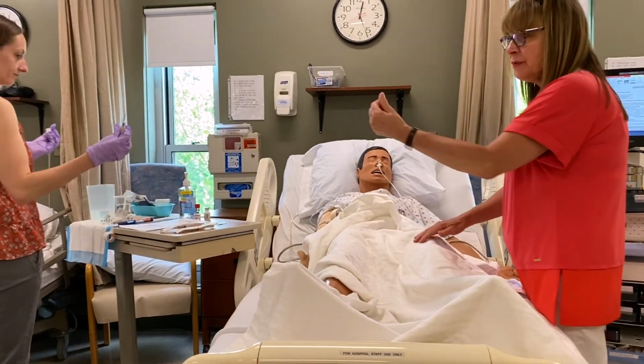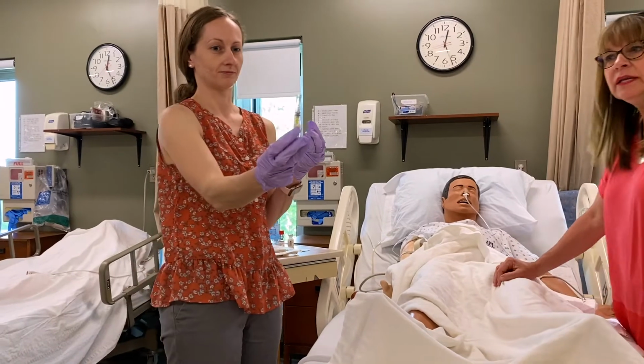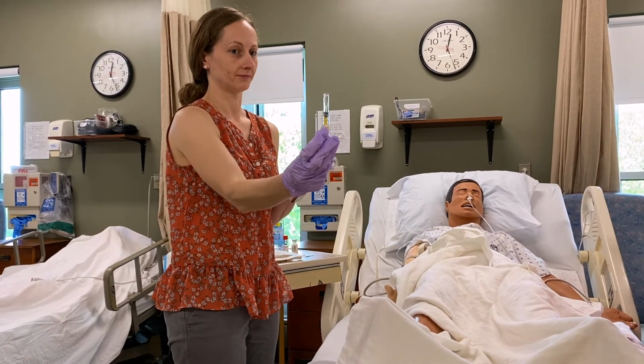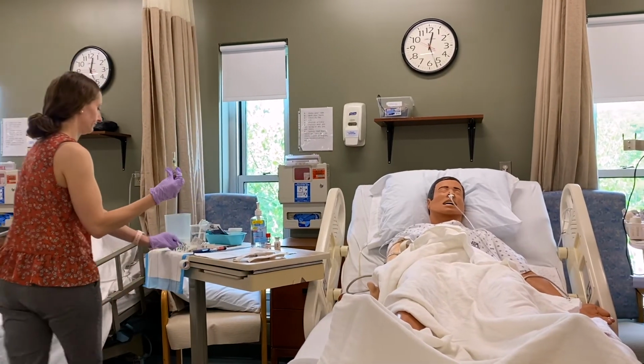And this, you can show the camera, this is a retractable needle. You just push on the plunger and it retracts, which makes it safer when you go to dispose of the needle in the sharps.